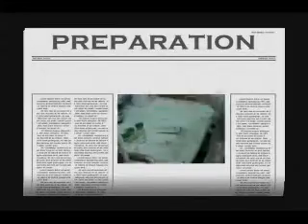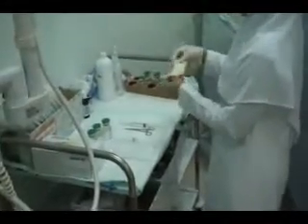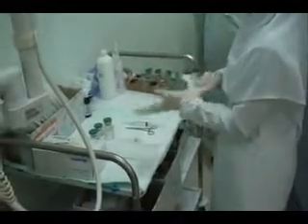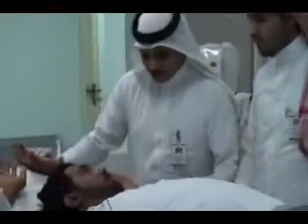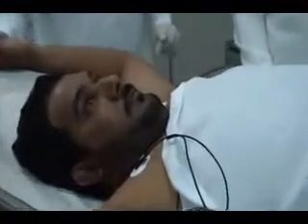Preparation. Before the exam, the patient will receive a contrast material, which will be injected into a vein, which would then make the vessel more visible in the pictures. The doctor would then attach electrodes to the chest for ECG gating. The patient would then be instructed to hold their breath for 10 seconds. If the breath is not held properly, multiple artifacts would occur.